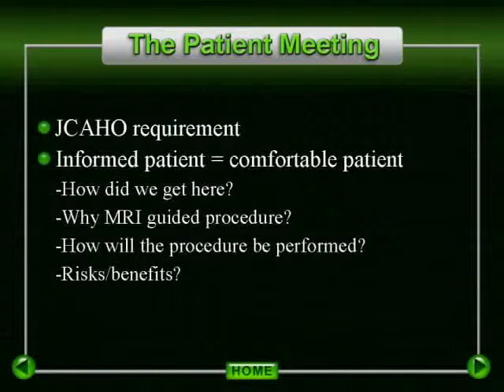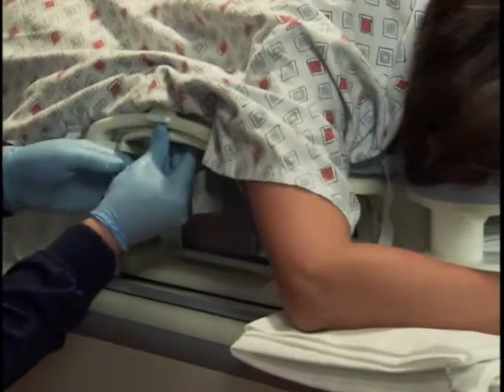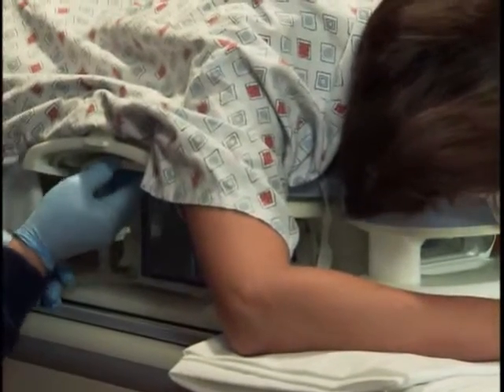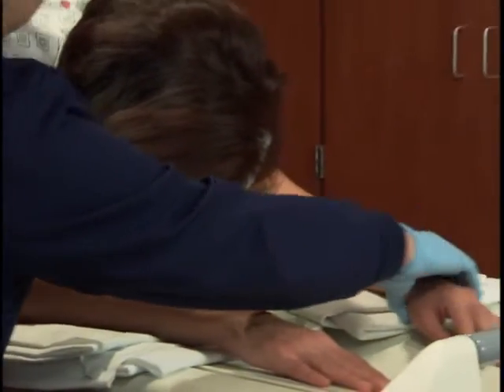The primary concern of the patient will be what kind of pain they can expect. Let them know what to expect. Most of our patients give us a 2 out of 10 on the pain scale, often with the initial xylocaine administration being the worst pain. If a vacuum biopsy is planned, we tell them that they will likely feel a tug or pinching with the biopsy. We let them know that we will tell them how many biopsy samples we will be obtaining, and we assure them that if they are having significant pain, we will further anesthetize the breast tissue as needed.